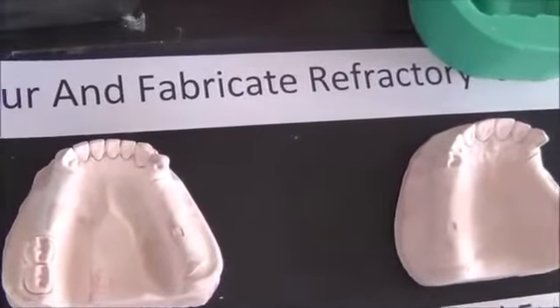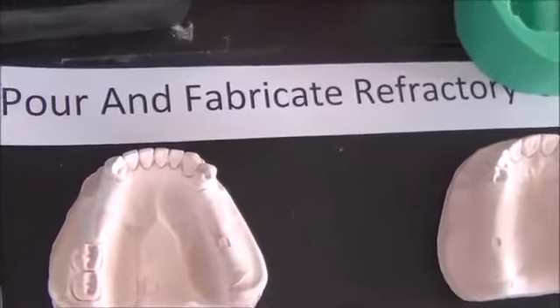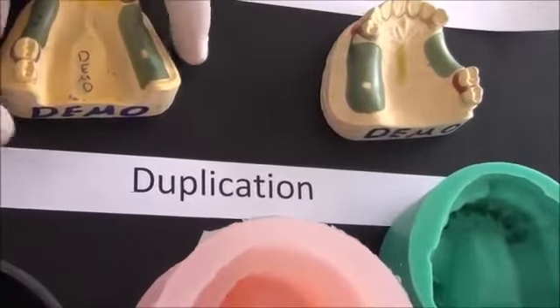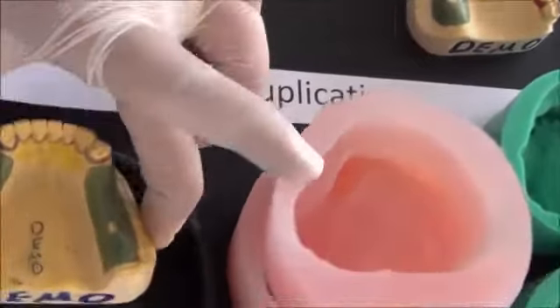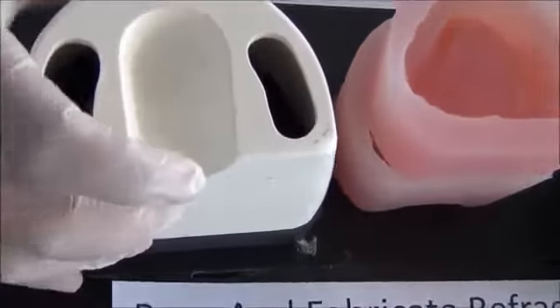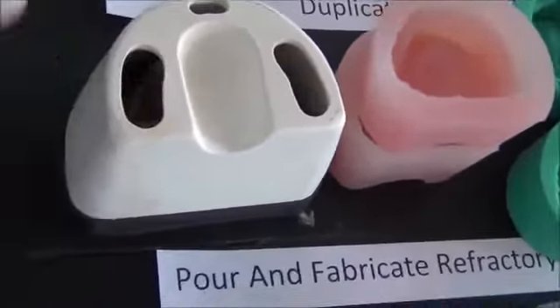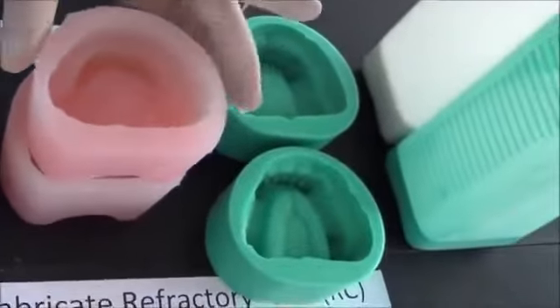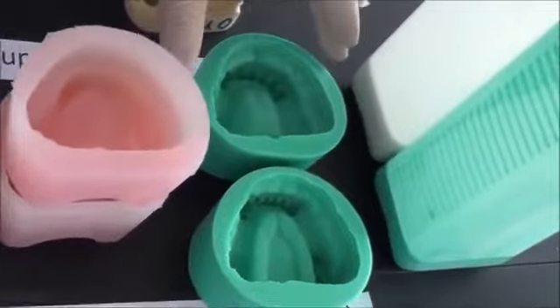So how do I change this to this? I need a process called duplication. By duplication, what do I do? I simply take out the cast, put it inside this flask, and close it, and then pour over it a duplication material. This material is usually made of agar or silicon.